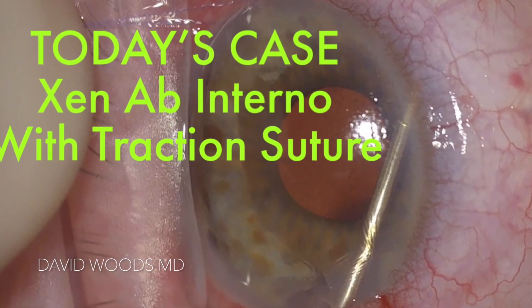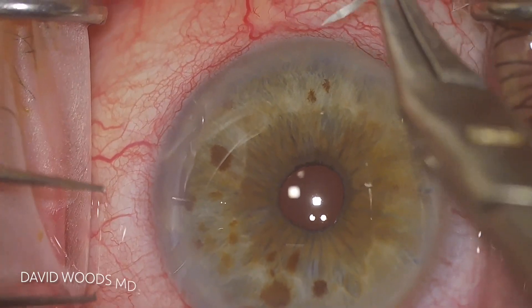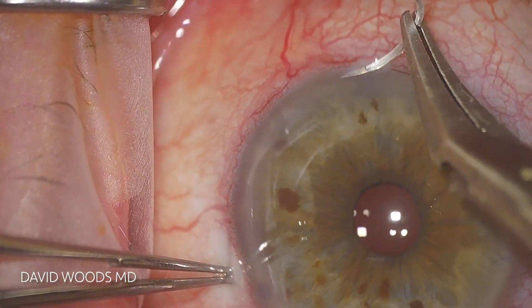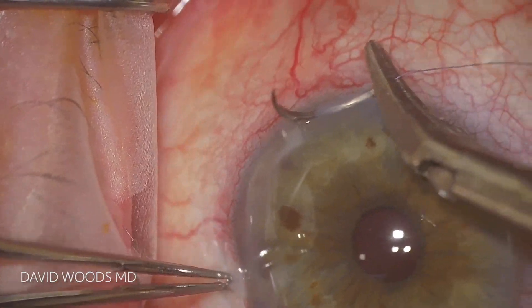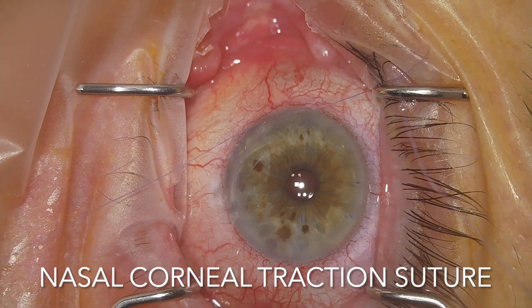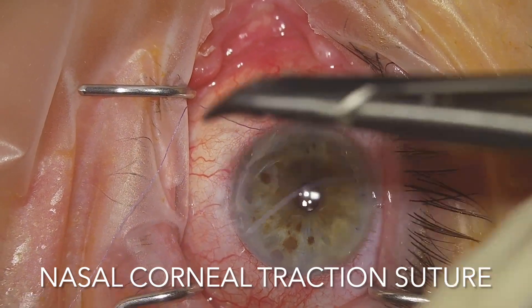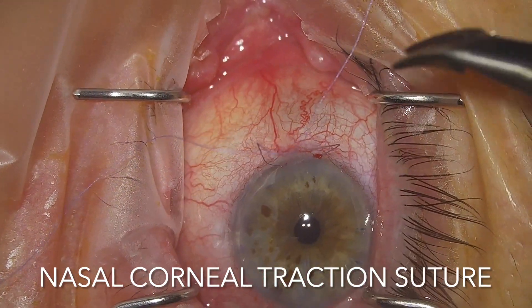Good morning everyone. Today's case is a Xen ab interno with traction suture, and I really want to spend time explaining why I like this technique. There are so many ways to do a Xen — ab interno, ab externo, and different modifications from each approach. This is an ab interno, meaning we're going through a temporal incision to implant the Xen as close to the 12 o'clock position as possible.